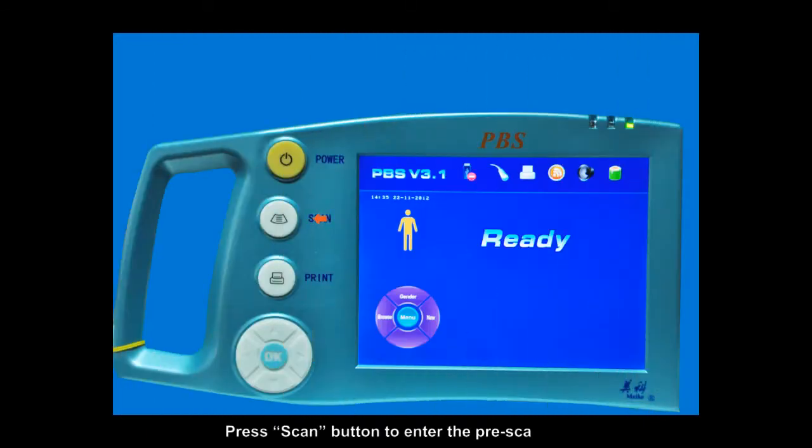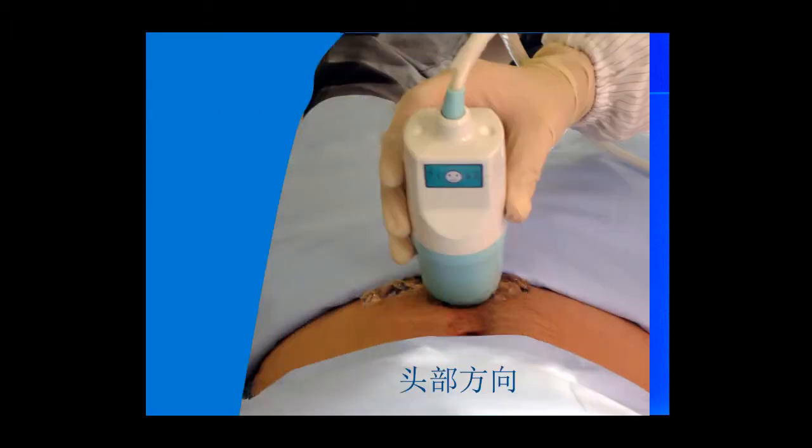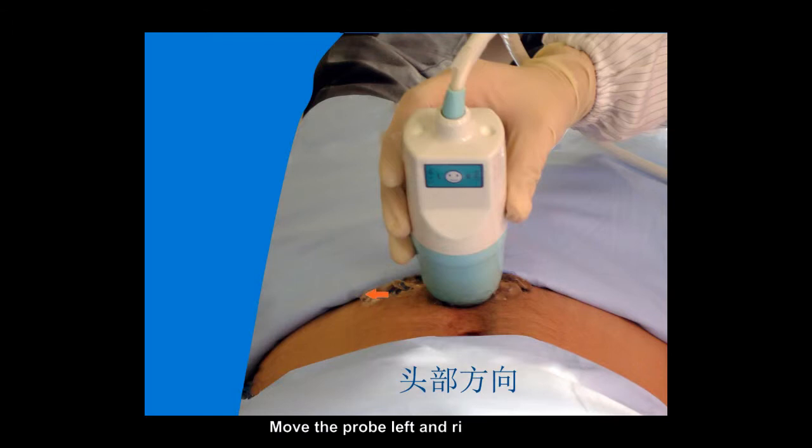Press the scan button to enter the pre-scan mode. Bladder image displaying. Move the probe up and down and adjust the lean degree slowly. Maximize the dark space of bladder volume. Move the probe left and right slowly.